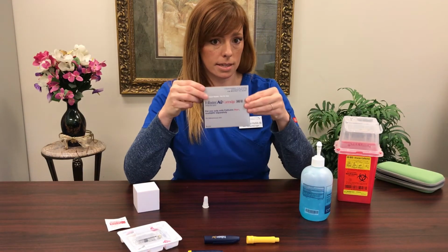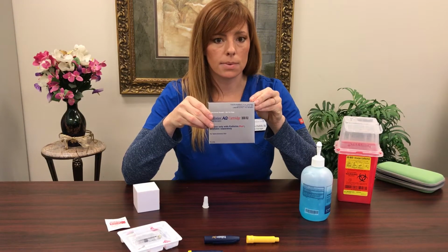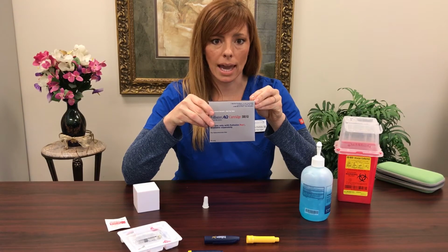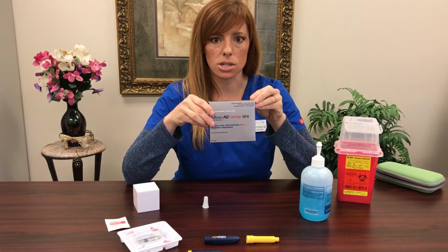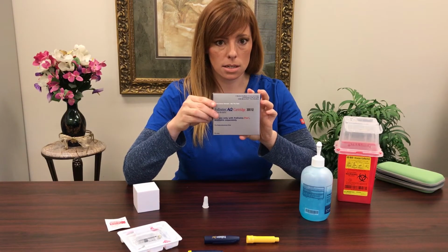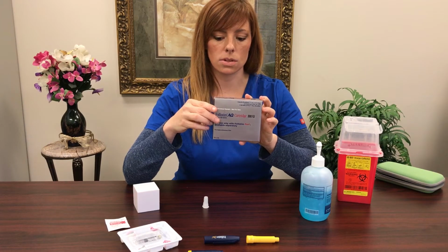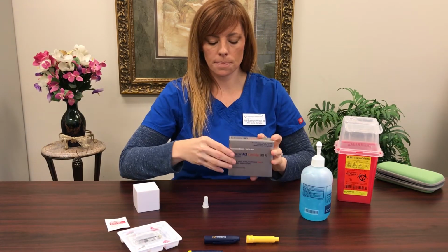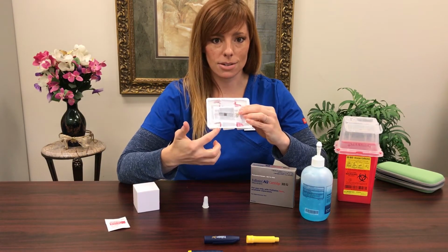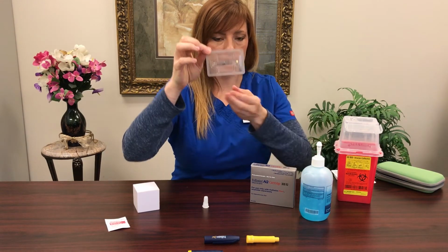Your cartridge, now this is the medication. These cartridges come in different dosing. You may find a 300, you may find one that's as much as 900 units. That's okay. It's just how many are in each cartridge. And so you can use these cartridges from day to day. Please do not dispose of them from day to day, as there is still medication in here that you'll want to use. Go ahead and open up your cartridge. When you open up your cartridge, it's going to look like this. They've given you more needles, and the actual medication is in a little sealed clear plastic container like so.